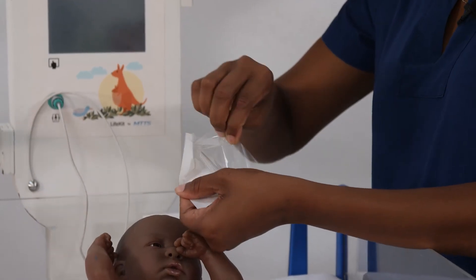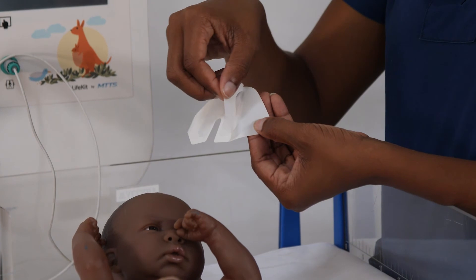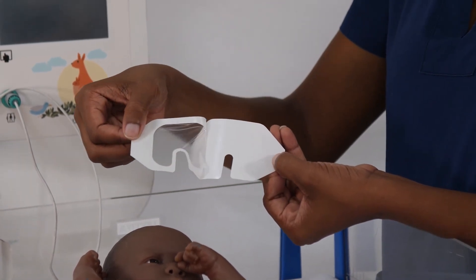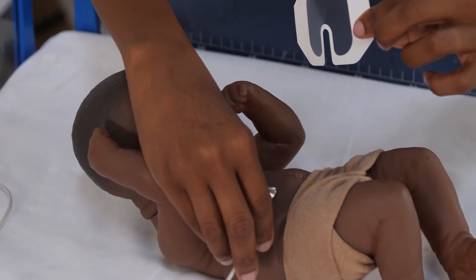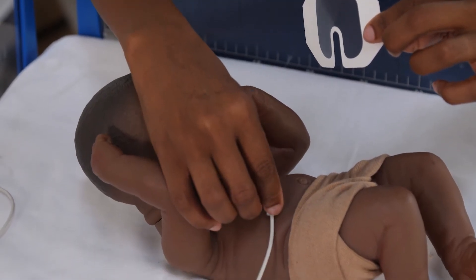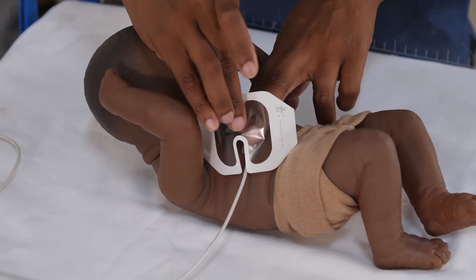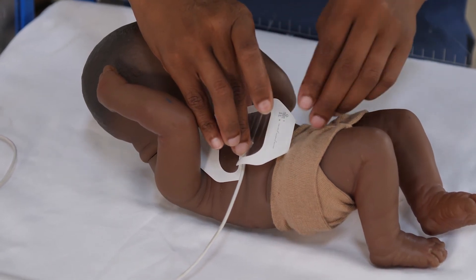Remove the tape from its packaging. Peel the tape off, holding onto the white paper on the outside. The probe must be flat side down, but the lid can come from either the left or the right hand side, as long as it is not tampered with by the baby. Place the tape gently to hold the probe in place.